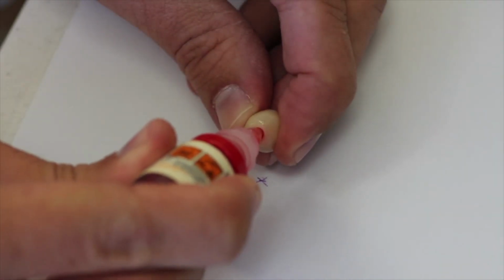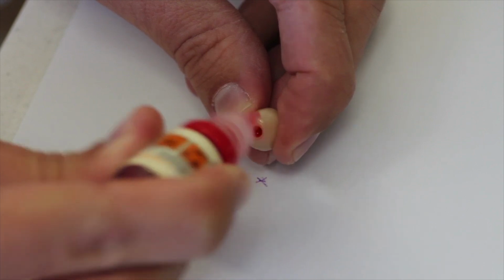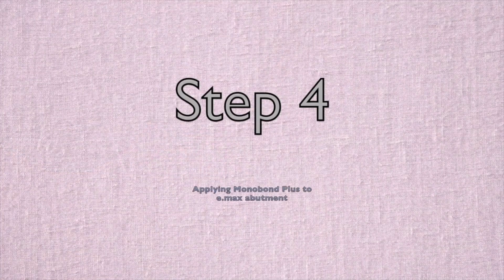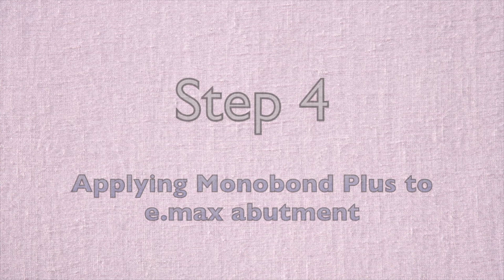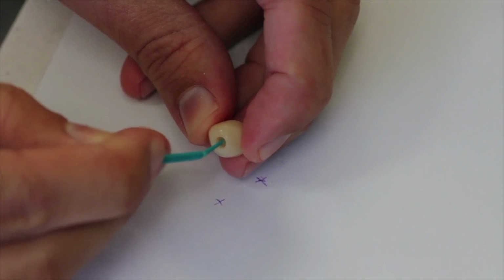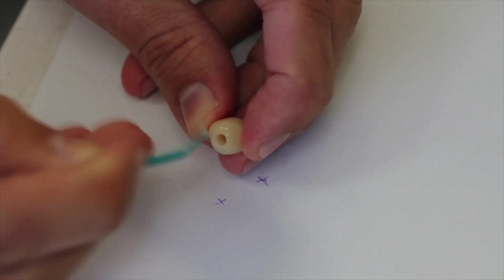Now we're going to move to the Emax hybrid abutment crown and apply 5% hydrofluoric acid for 20 seconds. After the reaction has occurred, go ahead and rinse this thoroughly. After the hydrofluoric acid is rinsed, go ahead and apply the Monobond Plus to the inside or bonding surface of the Emax hybrid abutment crown.